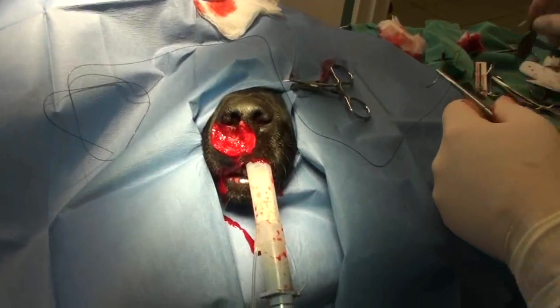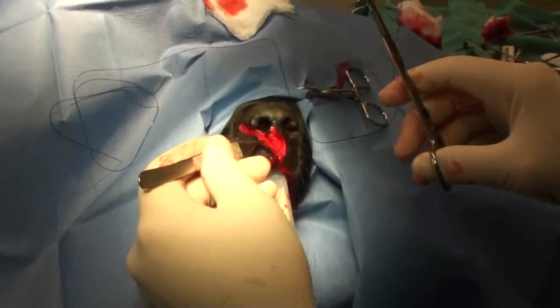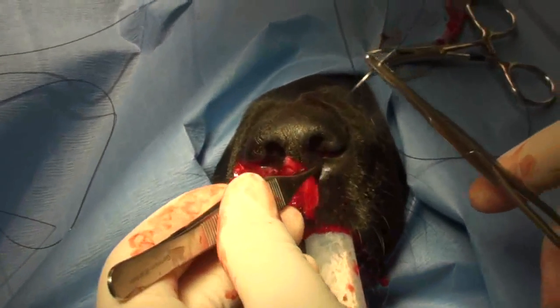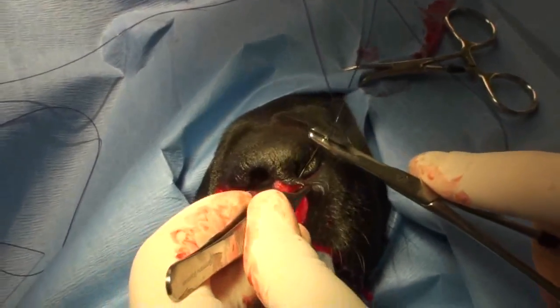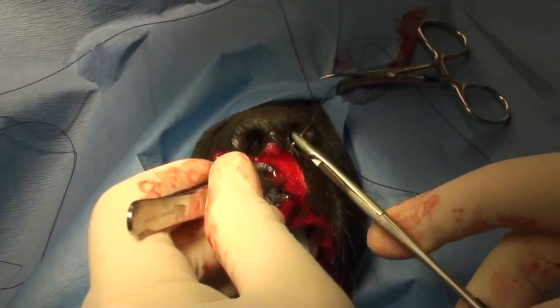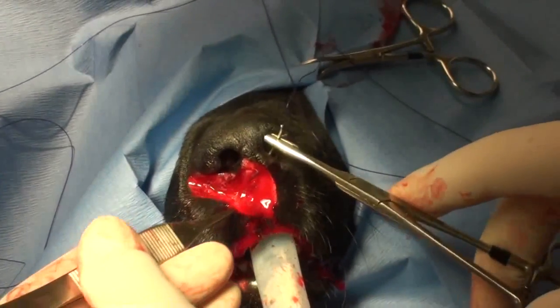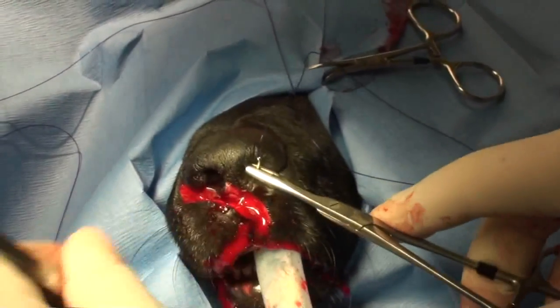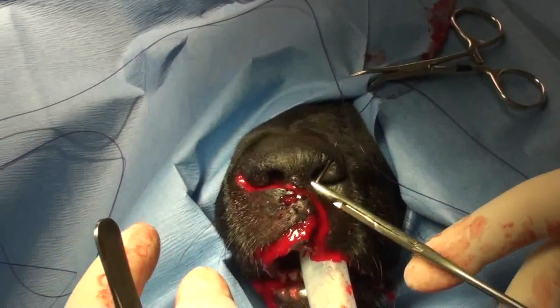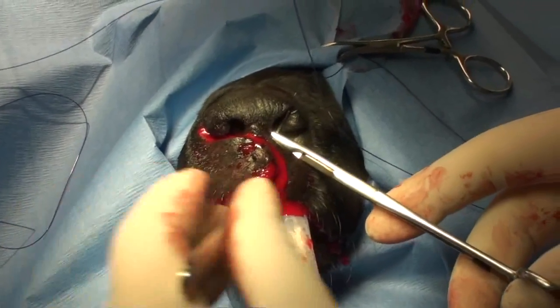On this nose, now we want to — it's like a jigsaw puzzle. I trimmed all the bad tissue away and now we've got to make it fit. I have to figure out where it's supposed to go. So I'm going to go right up near the nostril, push that through, and figure out where that piece should be. I think it should be right there. So we're going to push that through, look at it, and go — yeah, that looks about right. Maybe down a little more.